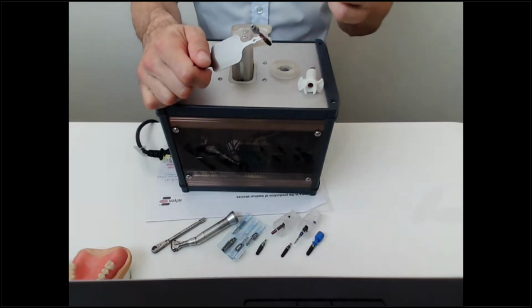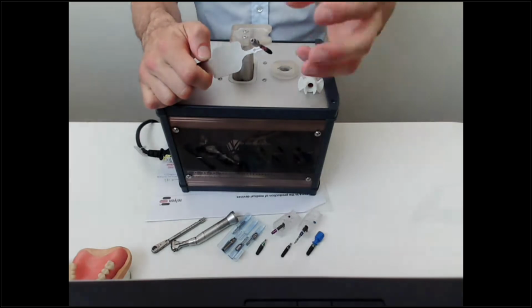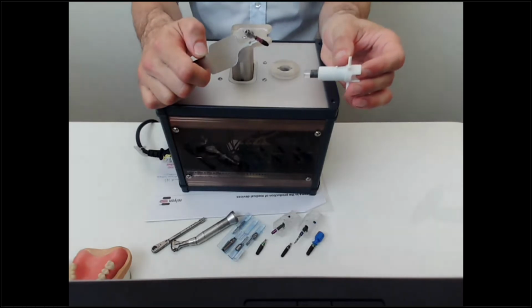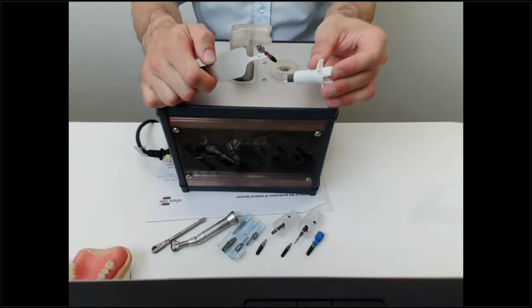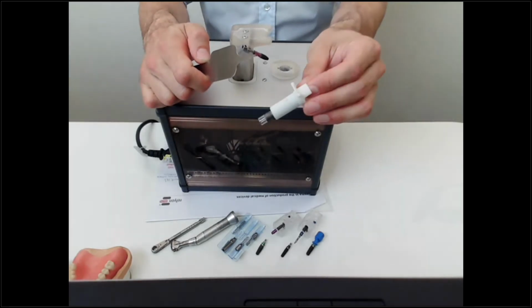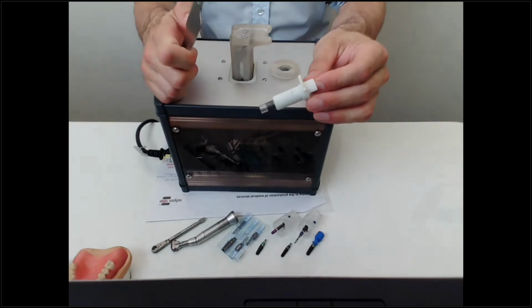And now you have selected and taken out your implant, and you know which diameter it has. We are planning to have three sterile reactor sizes available to activate all available implant diameters. So this is a medium-sized reactor for a medium-sized implant. This reactor acts as a sterile barrier between the implant and the non-sterile device.